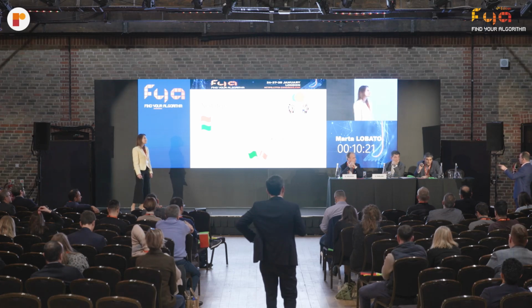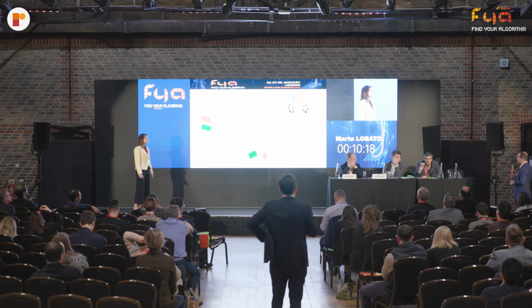Would you put it in the popliteal? Which size of filter then? I would have treated with a 5mm filter, easily a Spider filter, 5mm at the popliteal. But the popliteal is occluded. It's distally. The reconstitution is at the level of the bifurcation. There was a segment that was patent, at the patent segment. Okay. Only P2. I think the question was about how you will treat the SFA, right? No, the whole thing, all the lesions. I would have put it below the knee at the patent segment. Okay.